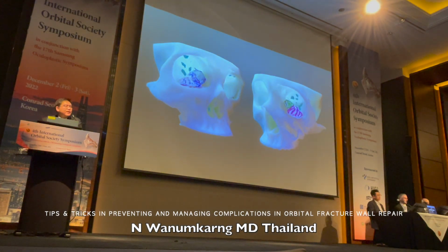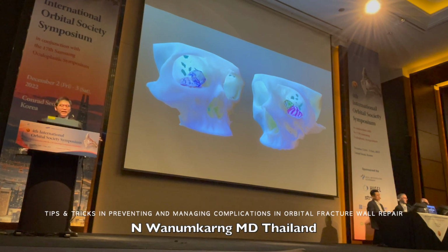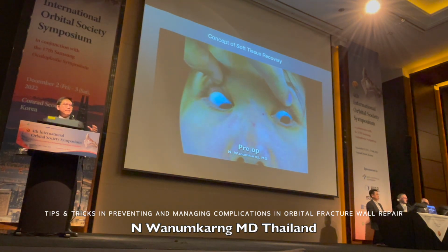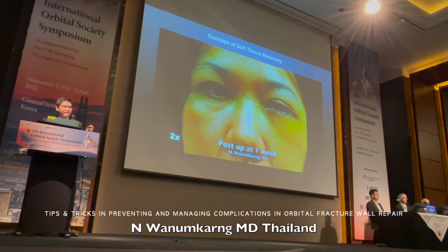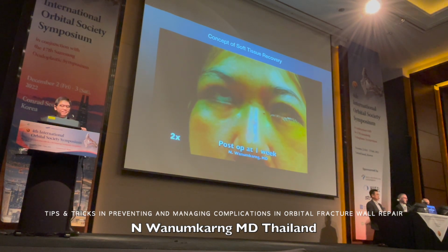So we decided to get the 3D skull model, and we use it pre-operatively. You can use a simple paper, cut it, shape it, and remember it, then flip it 180 degrees and imitate it on the fracture side. So at least we can know how many millimeters for the length, the depth, and the shape. When we customize the standard implant intraoperatively, that is less costly compared to a PSI implant.